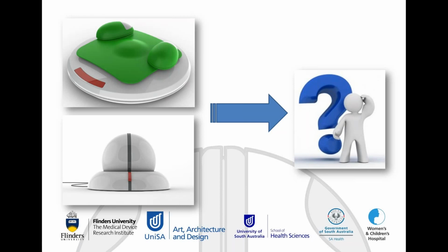So the requirement for the controller was you didn't use any buttons when you were in the game. You just focused on controlling the character in the game by moving the joystick effectively forward, back, left and right, and rotating or moving it around. But when you want to select a game outside of the game, you would use these buttons to actually select the game. This was a 12-week process to go from nothing to this, and we actually had working prototypes.